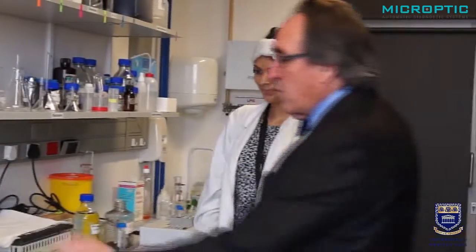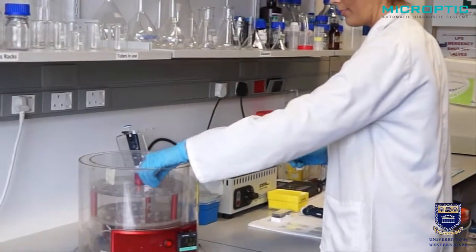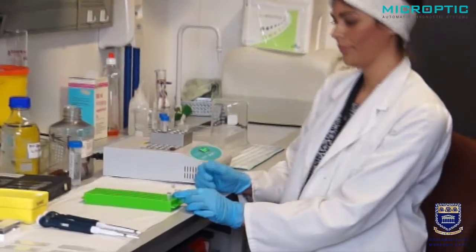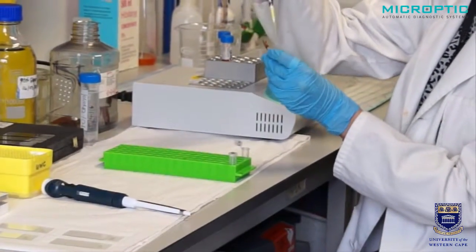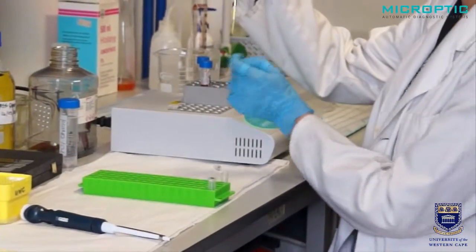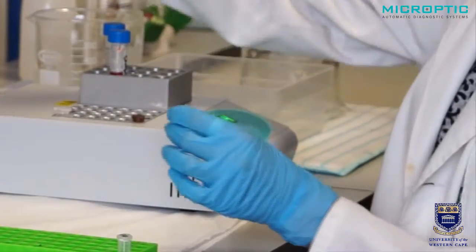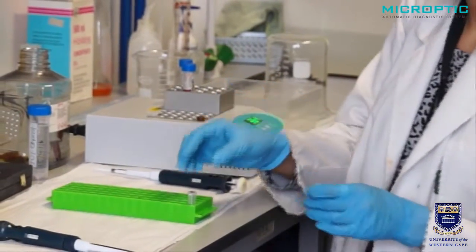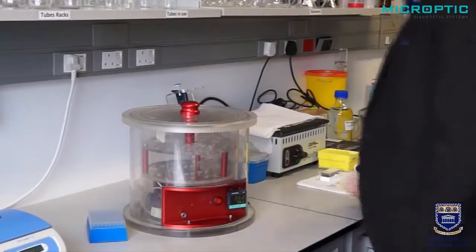Now we're going to show you how we incubate with a calcium-based medium to bring about the acrosome reaction. The tubes have now already incubated for approximately three hours. In one tube, we add a calcium-based medium. We will need to incubate it for a further 15 minutes before we stop the reaction with 70% alcohol. The control can now go back to the oven for incubation for 15 minutes.